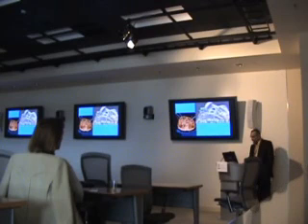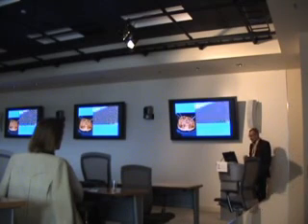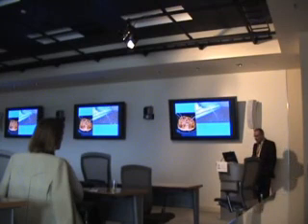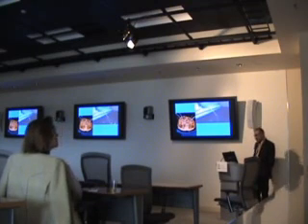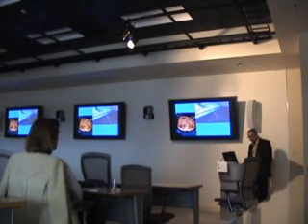Now, how do we prepare this model? We clean the vessels and flush them with saline to keep the vessels patent. Then we cannulate the major vessels in the neck, arteries and veins, and we also cannulate the subarachnoid space through the spinal canal to provide the CSF.